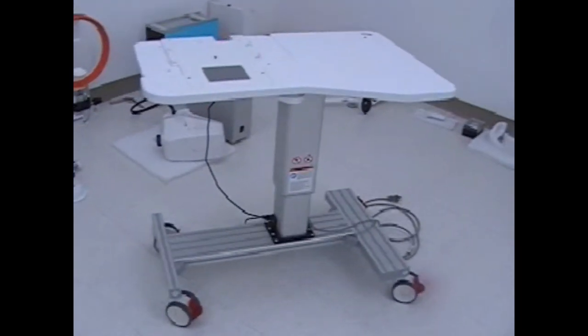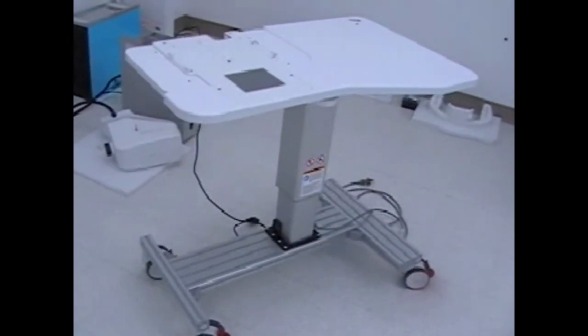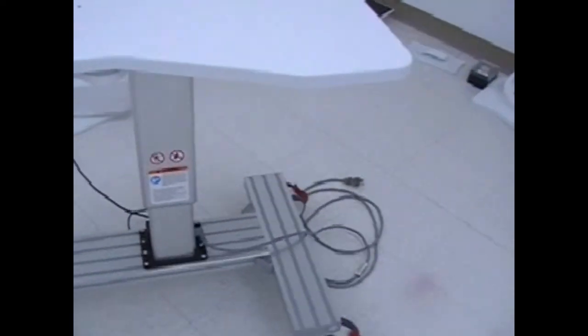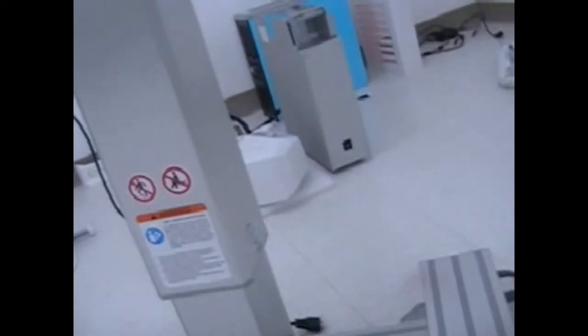The table has four locking wheels. Below are the hanging hooks for the controller and the computer. Computer to the right, controller to the inside.